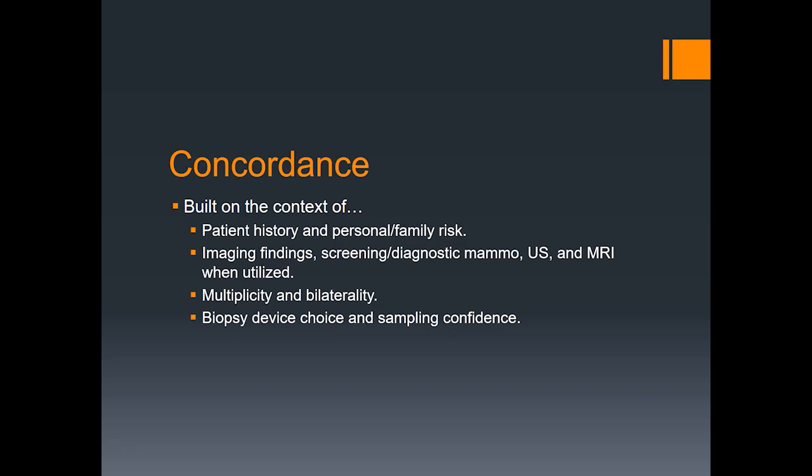As we think about 3D imaging, we are biopsying subtle distortions. And as we biopsy those, whether on ultrasound, when concordant on ultrasound, or utilizing tomographic biopsy and guidance, we have to think about what that gauge device is, what our follow-up imaging might be to assure that we have thoroughly sampled that area, and our confidence subsequently.